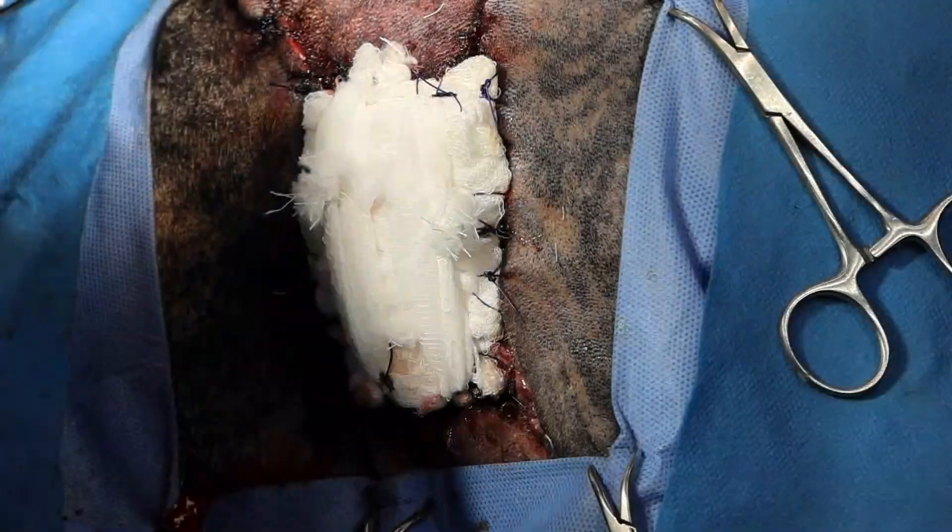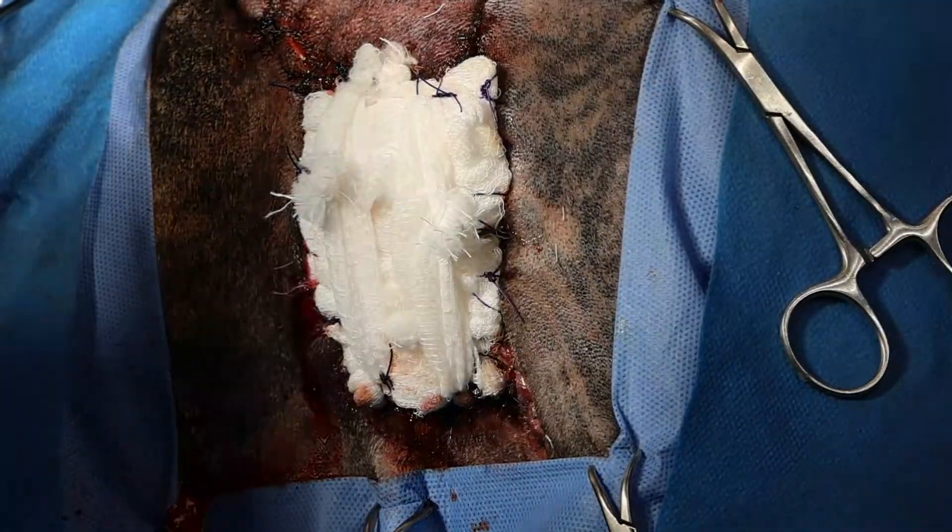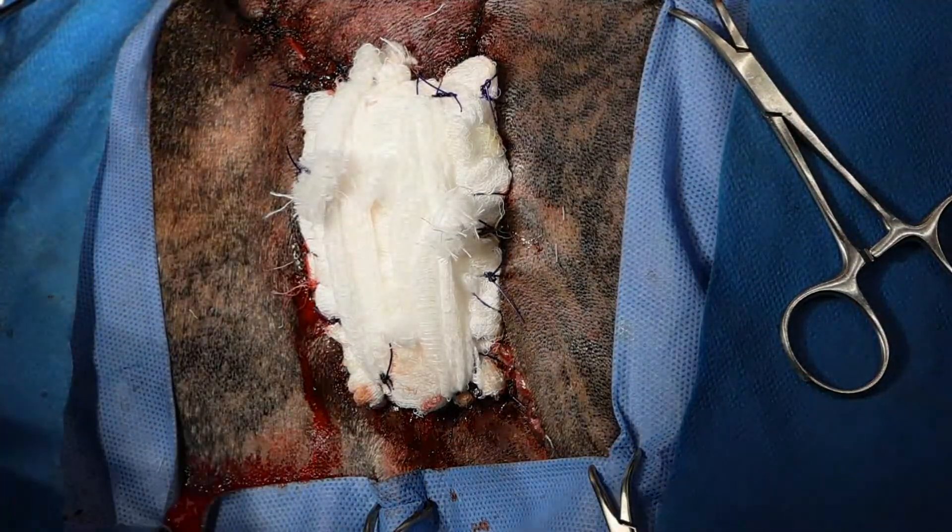I'm just going to put in one more. I'm just going to do one more little skin suture here.